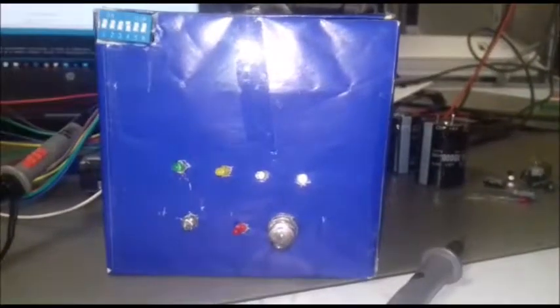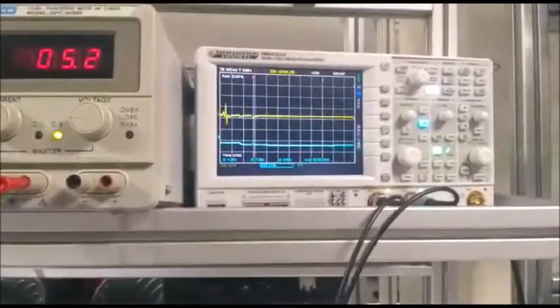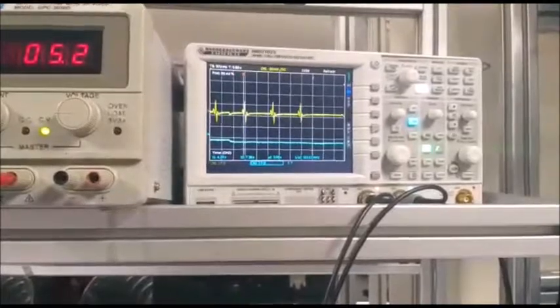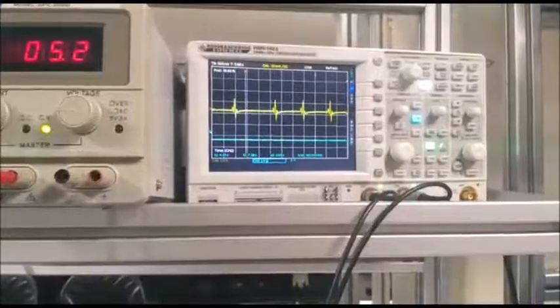And finally, there is bradycardia. In this pathology, the equipment is not used. In this case, the patient signal is shown, and the blue LED lights up.